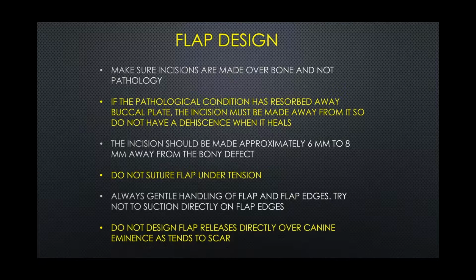A couple of key points about flap design: when you're suturing your flap, make sure you don't suture under tension, and we'll talk about that in a few seconds. Always make sure you gently handle your flap. You don't want to tear the edges. You don't want to suction directly on the tips of the edges. You don't want to be suctioning and banging on those especially thin flaps, because we know that the areas will necrose and dehisce, and it wouldn't be good for our healing.